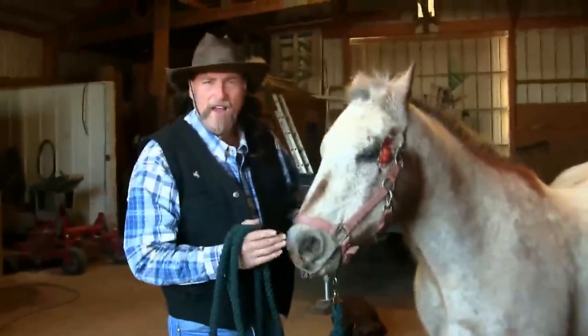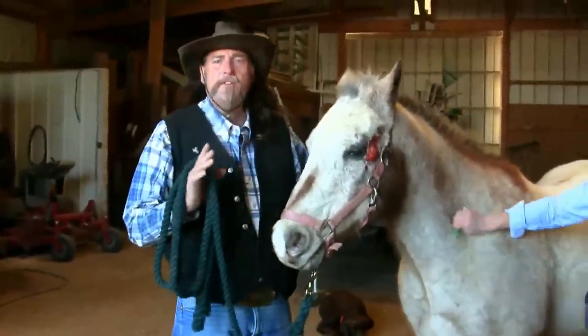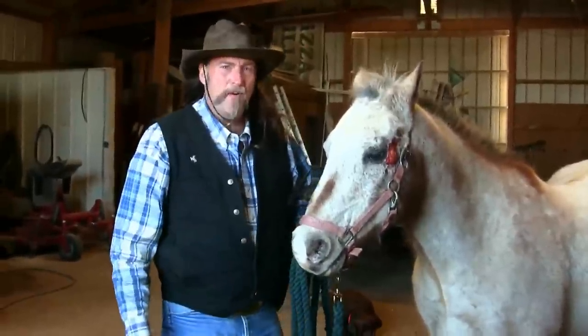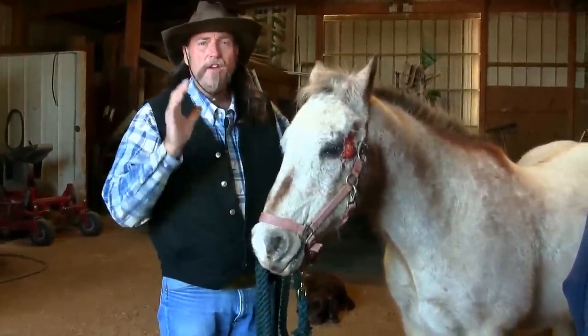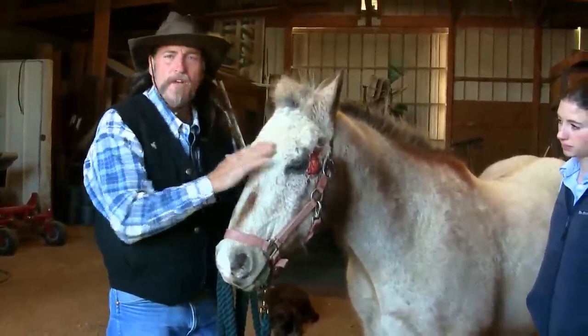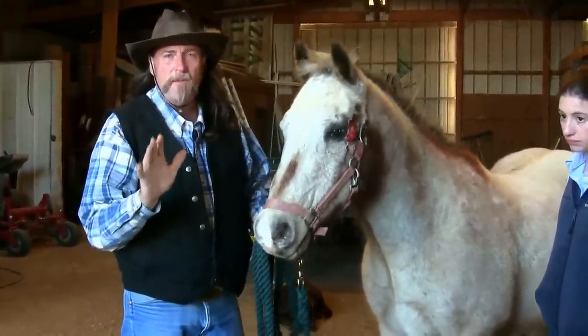We just give it straight in and pull straight out. The purpose of this video is not for you to watch this and go out and start slamming needles and syringes into the neck of your horse. The purpose is so that if someone who is not a professional licensed veterinarian is going to give your horse injections, you now know the proper way it's done. This is about safety for the horse and making sure no one is giving you a raw deal by claiming they know how to do something when they don't.